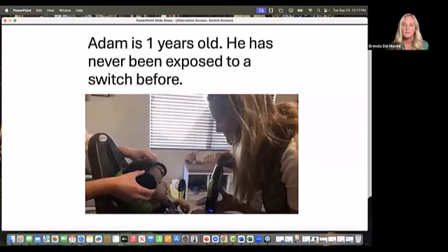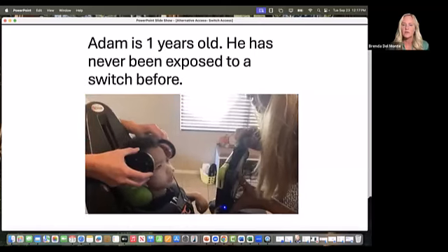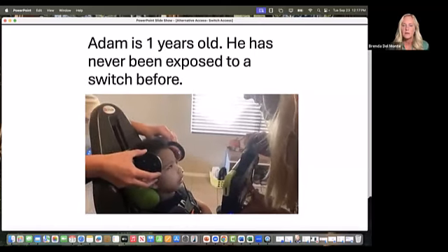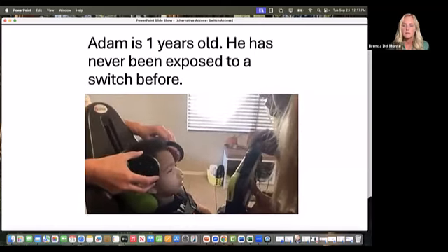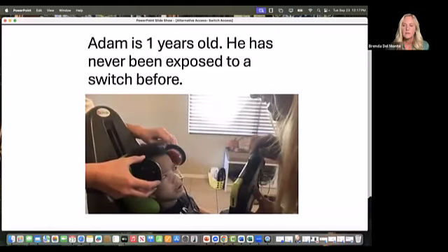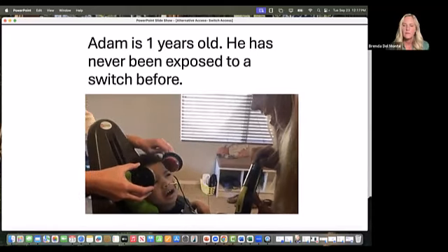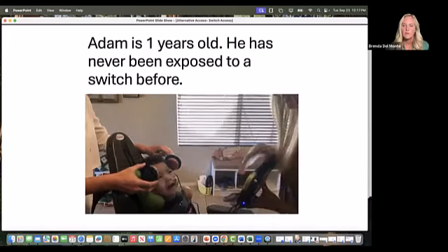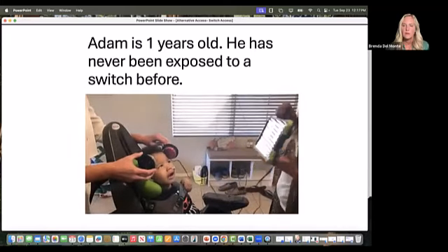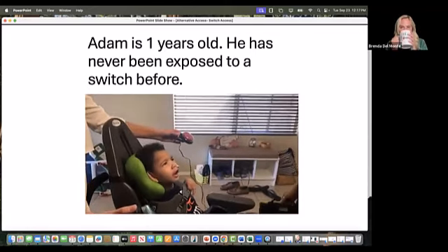Music. He's moving to the left on the red switch and it's scanning through his choices. Music. You want different music. Okay. Let's sing. Let's sing a song. You're going to sing. It's a favorite. Itsy Bitsy Spider? Good, or Patty Cake, actually.